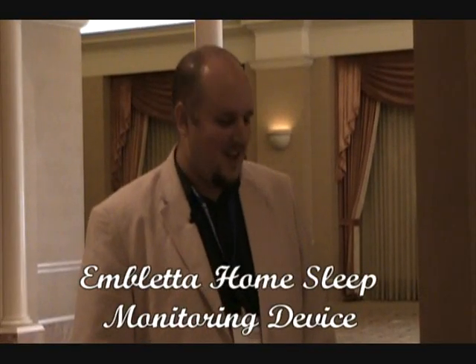I'm John from Sleep Group Solutions and I'm going to go over how to hook up an Embleta on a patient and give them instructions to go home and do a study.